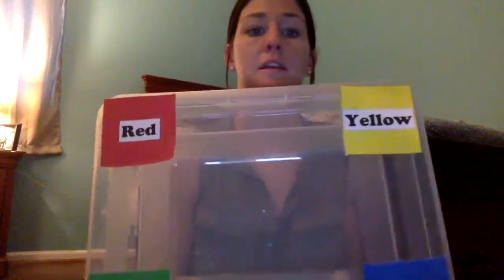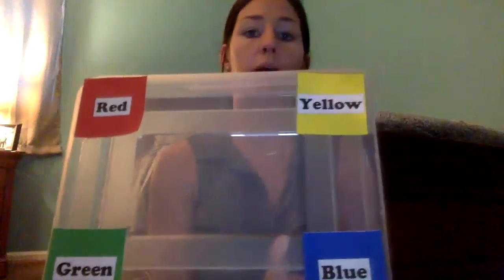My second activity is one that I would call in my classroom manding, or requesting for items. In John's case, these manding sessions would look more like things that might be physically challenging for him to do, but he might have interest in, such as listening to music, drawing, reading, and going outside. So let's say he motioned to drawing. Then the board can switch to create different colors used to create his pictures. And the colors themselves are reinforced with the words, as you see here: red, green, yellow, and blue.